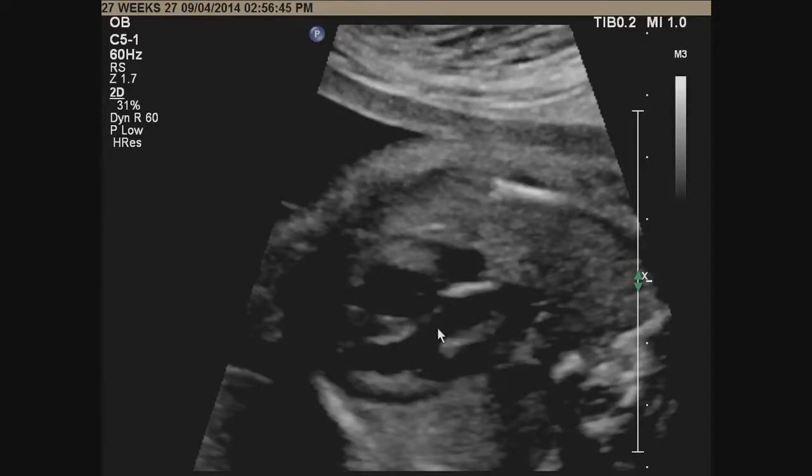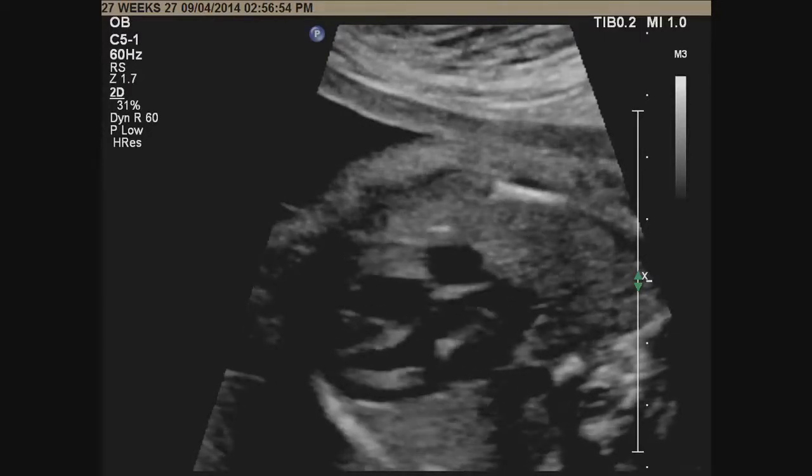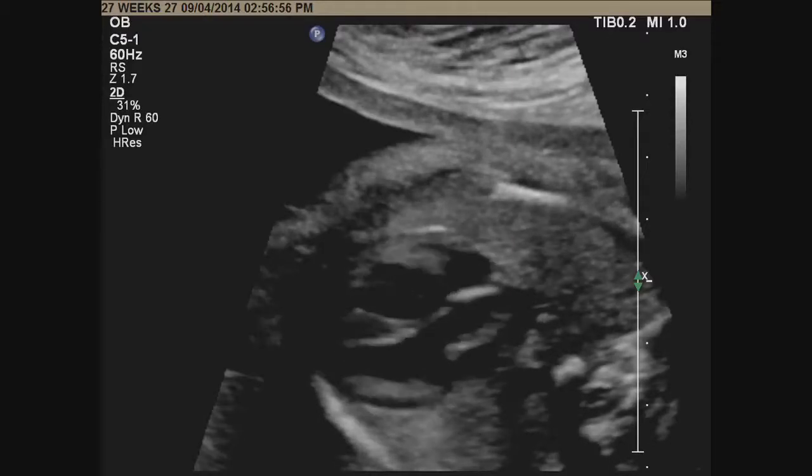In mild aortic stenosis, one of the features is you still see some valve leaflets that can't open all the way into the heart. That should be your clue to look at. The third thing you need to look for is when you look at the ascending aorta, look at the size of the aorta. It should be uniform throughout as it comes out. Many times with aortic stenosis, you have post-stenotic dilation of the vessel, so you have ballooning of the vessel after the valve annulus. And you look here, it's nice and clear.